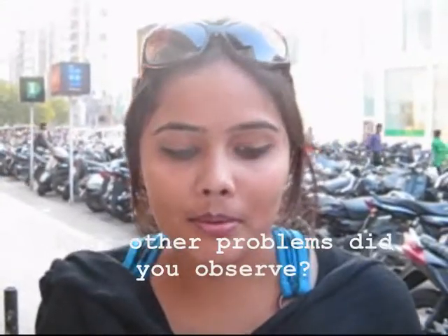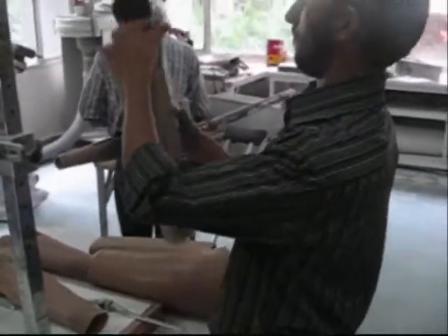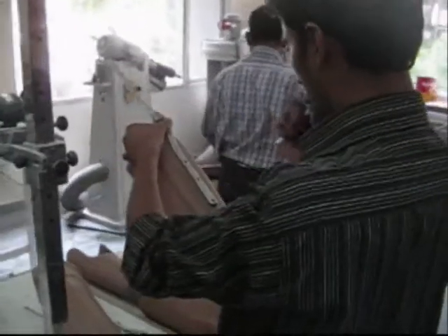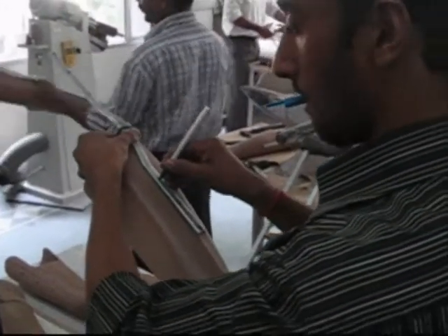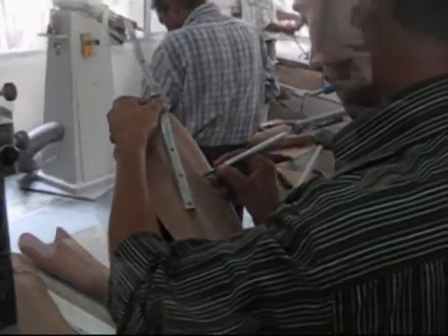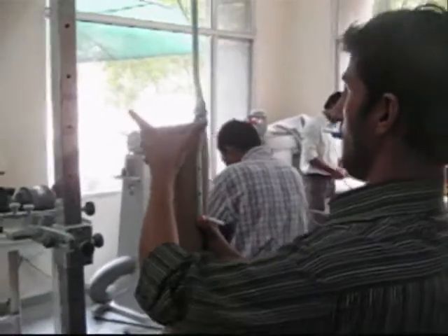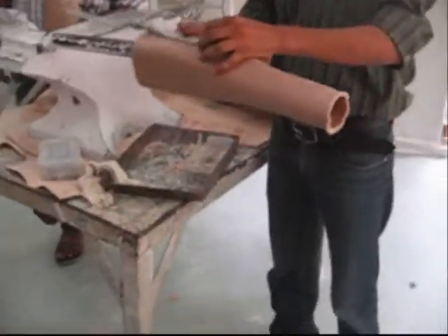What other problems did you observe? At first sight, the assembly of prosthetic devices looks uncomfortable — it looks like technicians have a hard time aligning the components and have to perform many steps that could be skipped. Yet they are incredibly fast. The steps they follow are precise and repeatable, and according to their supervisors, the experience and skills they have developed make up for this apparently difficult process.